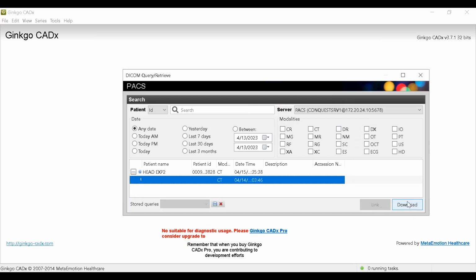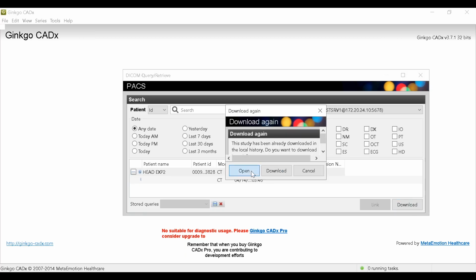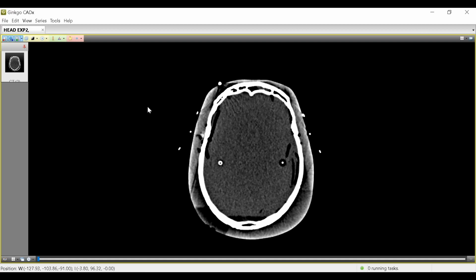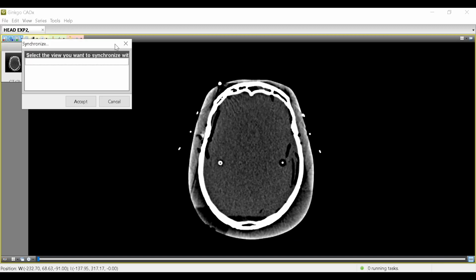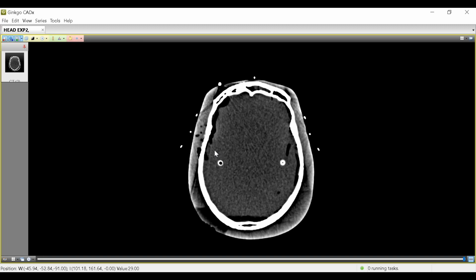Over here, it actually has a button that says download. I can download one or the other, or I can just double click on it and I want to say that it does it. So let's go ahead and download it. It told me, hey, do you know that I've already downloaded it? The reason why it said that is because I double clicked on it sort of instinctively. And there you go, there's image one. Here's image two, wait a minute. Where's my 1, 2, where is it? There we go. Right, left arrow on the keyboard. Image 1, image 2. I got my two images.